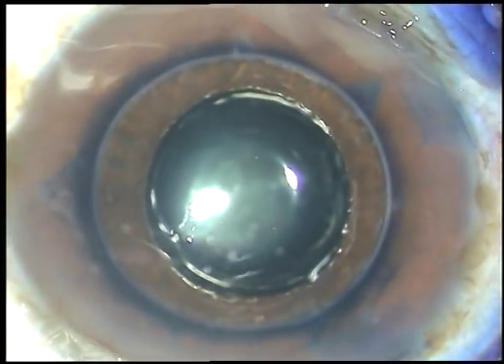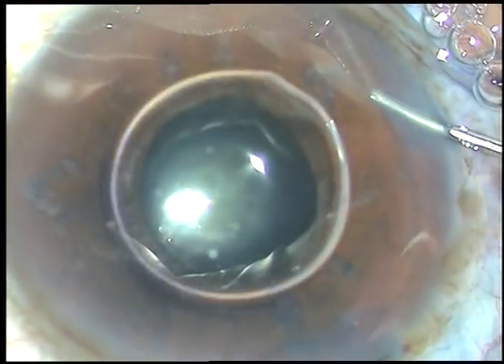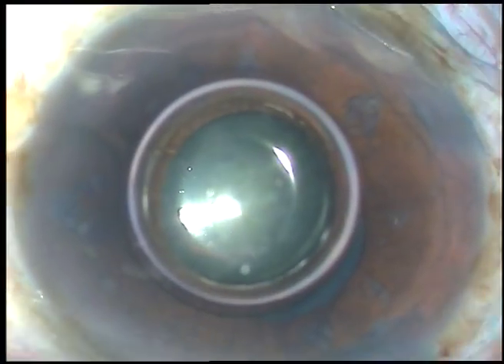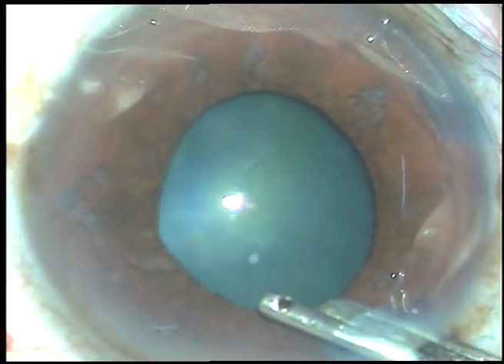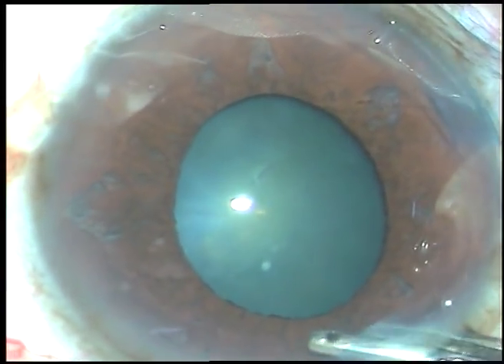Now a little bit of adrenaline is being injected — actually a lot of adrenaline has been injected but the pupil didn't dilate much. You can see a little bit of dilation superiorly but it is not enough.